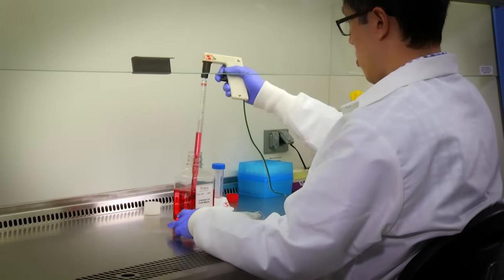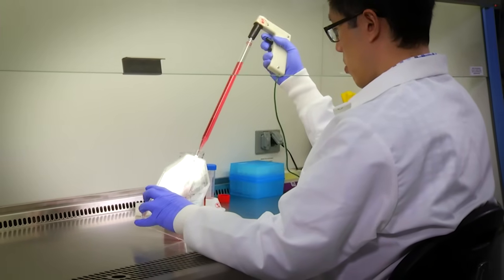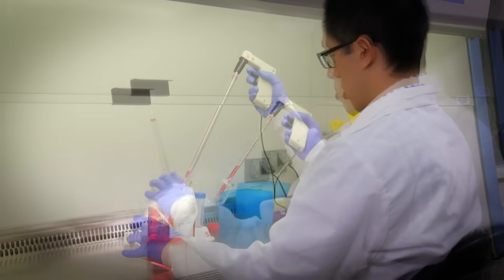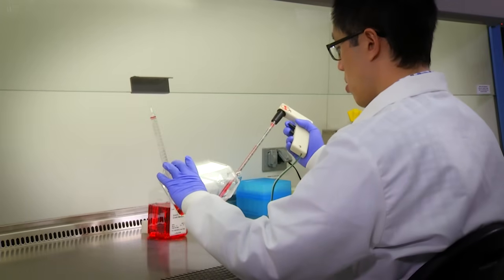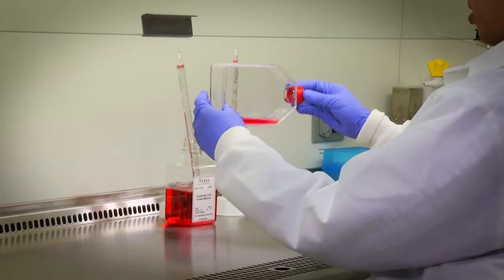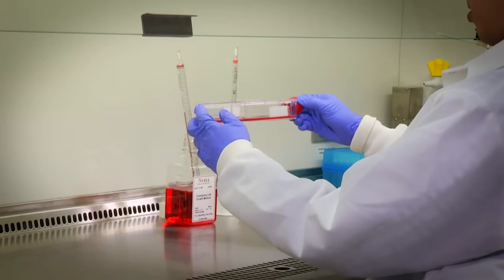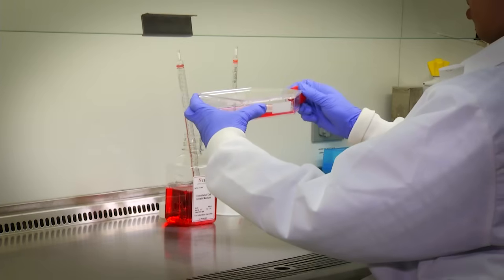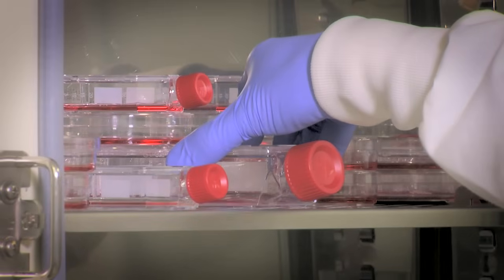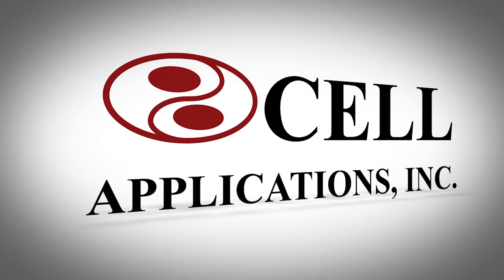Pipet 30 ml of growth medium into a T175 flask or flasks depending on the cell number. Cells are seeded at 5,000 cells per square centimeter. Inoculate the T175 flask or flasks. Cap the flask and rock gently to evenly distribute the cells. Loosen the cap to allow gas exchange and place the flasks in the incubator. And that's it. Following these guidelines will provide you with healthy cells and solid data.